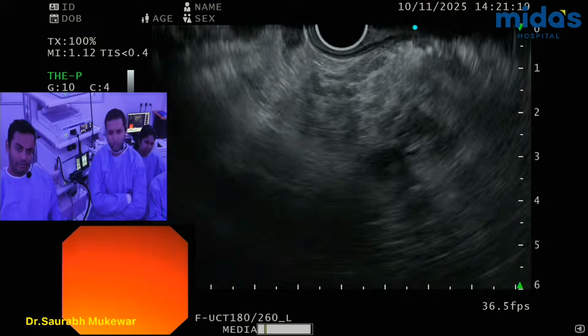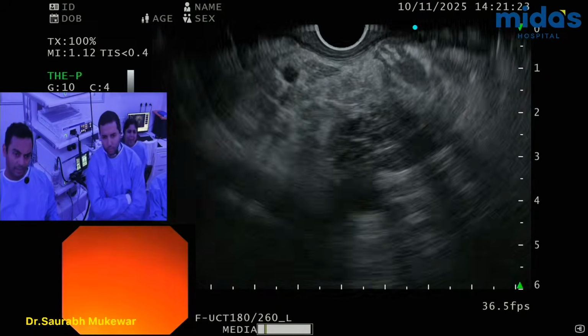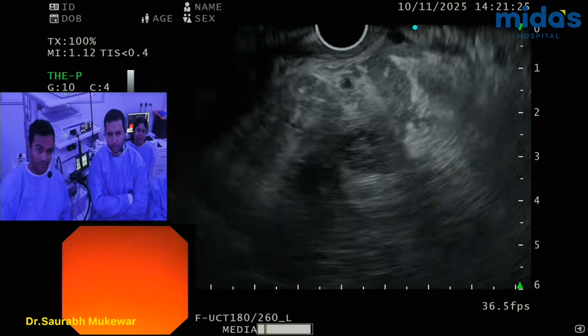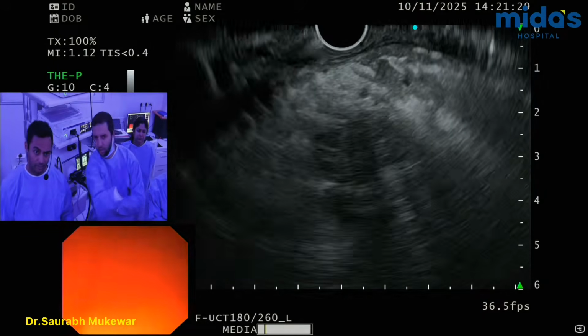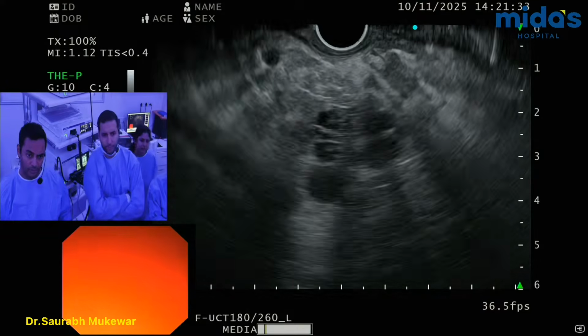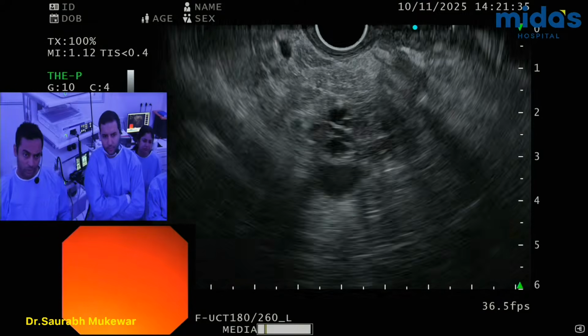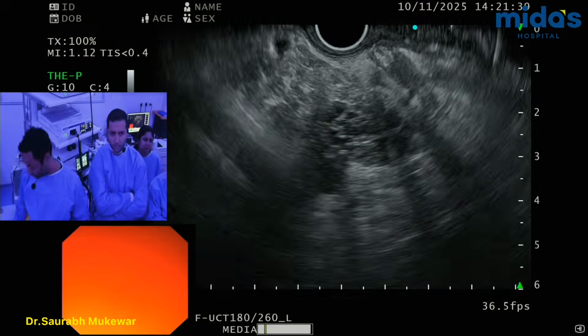I think that little bit of that blood clot is now caused. Yeah, okay, that's the perfect position, but it's as good as it gets. I can't get better than this. Yeah, so that's it. You push a little bit to have the lesion. Yeah, I think what I'm trying to do is trying to push and pull and get the scope and scope hold. Yeah, that's it. So this is as good as it gets. I'm not going to get better than this.